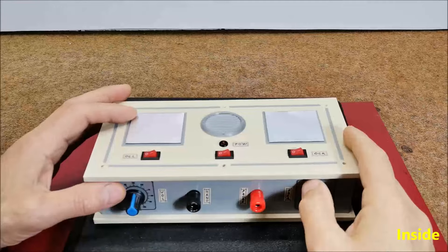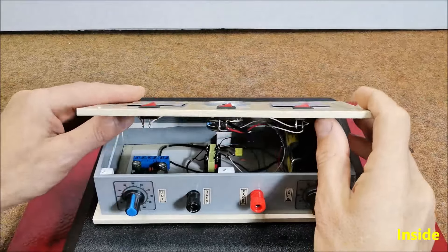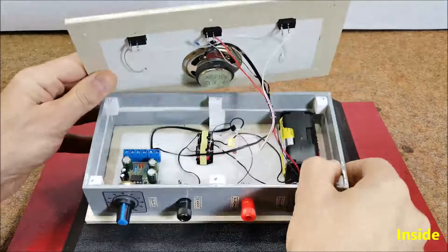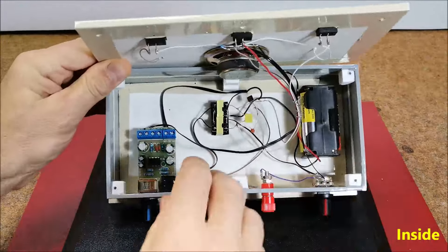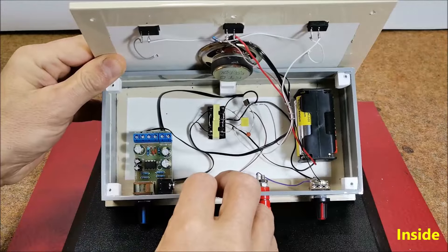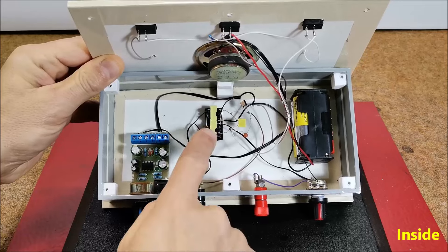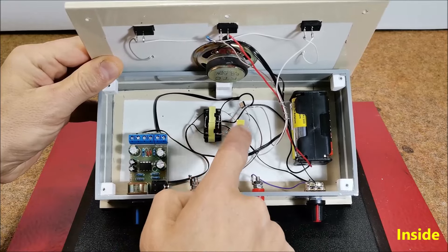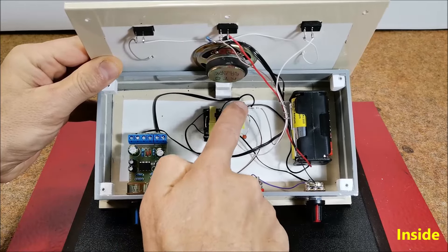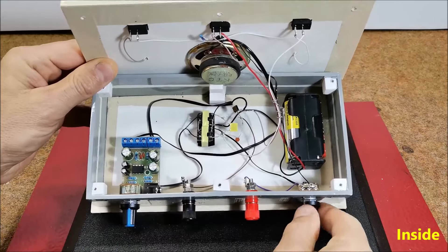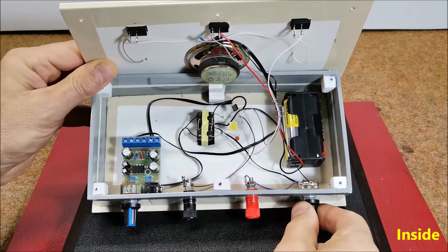And now let's look what's inside the box. The main circuit consists of trafo, two capacitors, transistor and potentiometer.